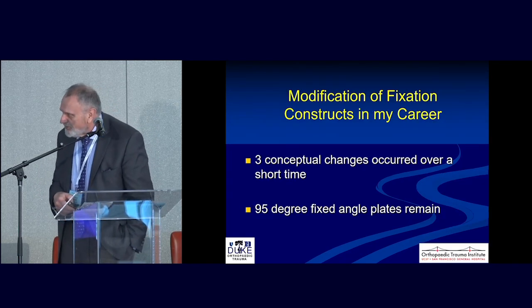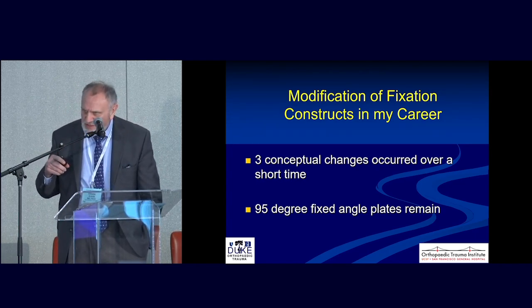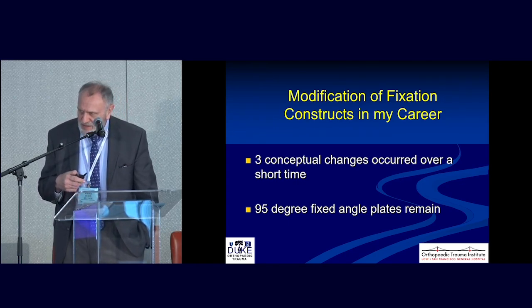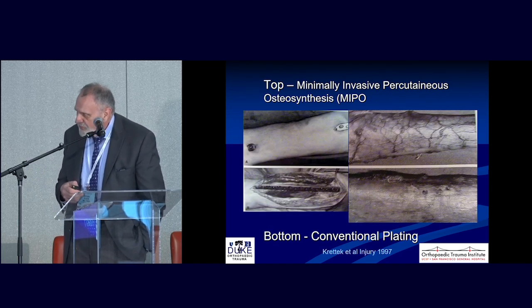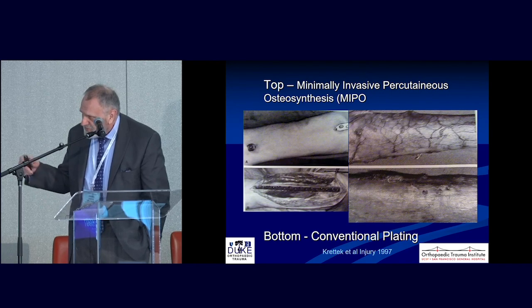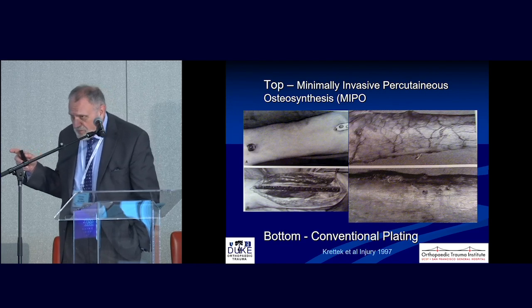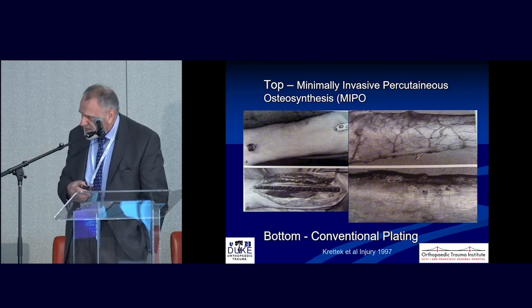Anyway, I think one of the things that has happened, and I think we see it in the distal femur more than any other area, is that for most of the faculty within the time of our career, there have been evolutions of techniques in plating. And really, the first thing I want to point out is this minimally invasive percutaneous osteosynthesis, or MIPO. This is from the original article Krettek wrote, and actually Tet Miclau is a co-author on this article. But this is where Christian was showing that if you do this subcutaneous pass of the plate, you don't disrupt the periosteal blood supply, where if you do it open, you tend to do that. So the idea that is minimally invasive, or MIPO technique, is a concept that has become important.